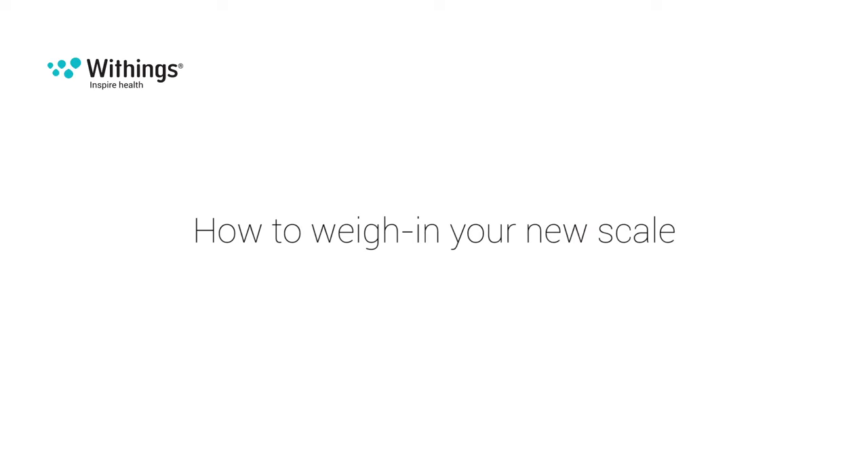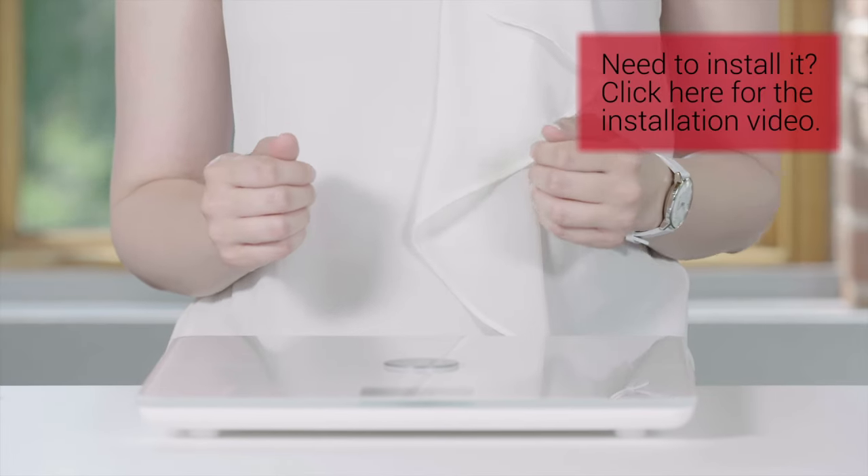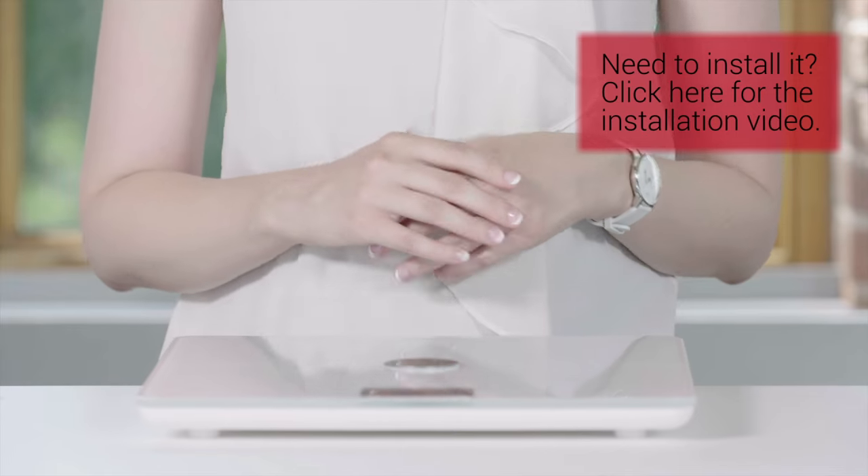Let's learn how to use your new Withings scale. After you install your scale, you can take advantage of its features. Let's learn how to weigh in.